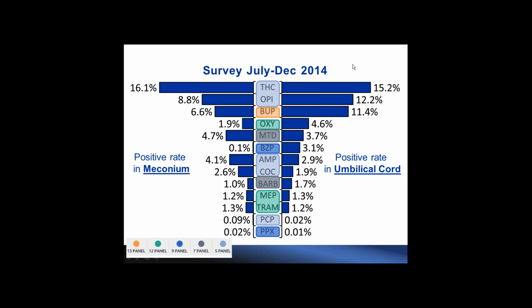And that may explain some higher positivity rate we see from ethyl glucuronide, which is the kind we test in umbilical cord. And we always tell the clients that when you receive the samples and the test results, always confirm by site visit. Visit the family, visit their relatives, and ask some good questions to see if there are some clues about this.